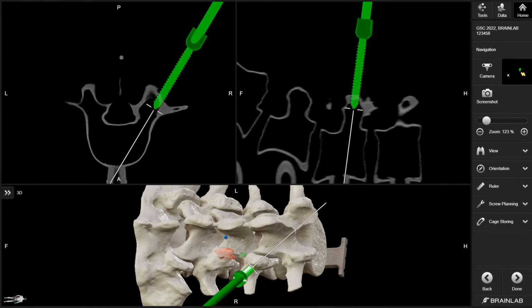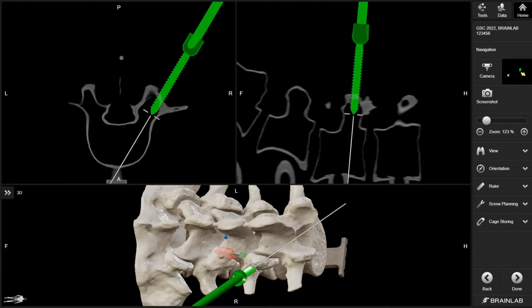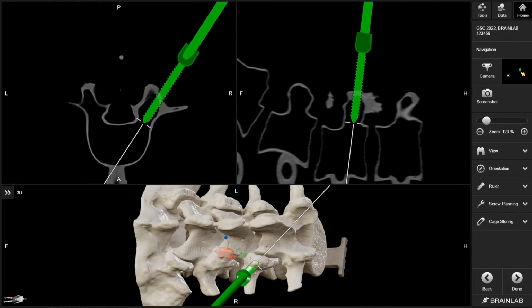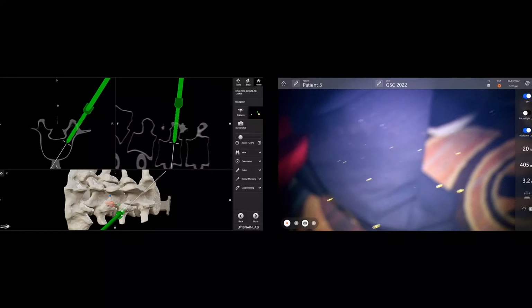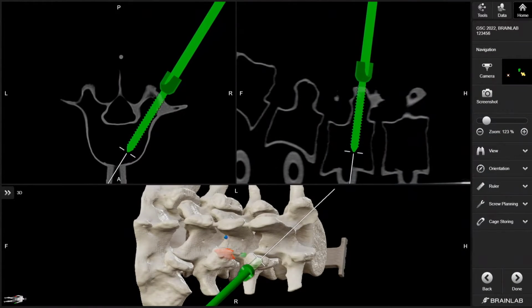See, because it's so aggressive, you don't really need to drill an entry, but you can. If the bone is very, very hard, there's an instrument that we use, a navigated awl tip tap. That's very, very aggressive that you can also use. And we use that in very small pedicles or if the bone is very hard. Once you pass the pedicle, you retract the K-wire, and then you go down. If the patient has good bone here, I like to take my hands off to confirm really accurate placement of the screw. So I'm very happy with what that looks like.